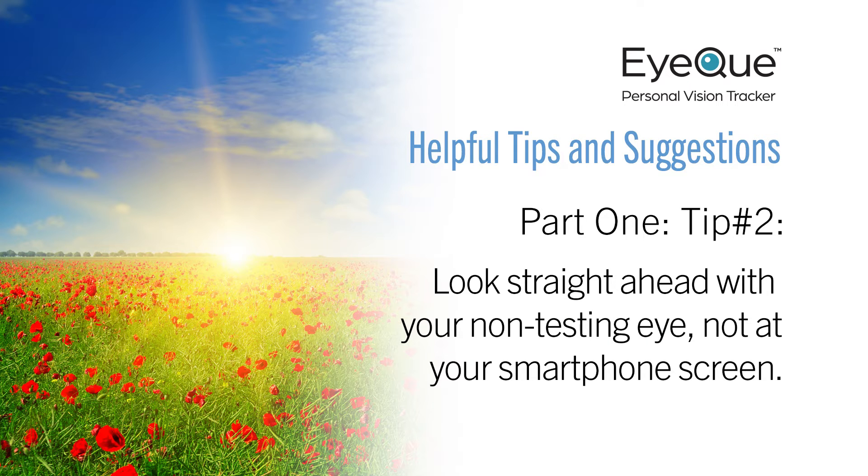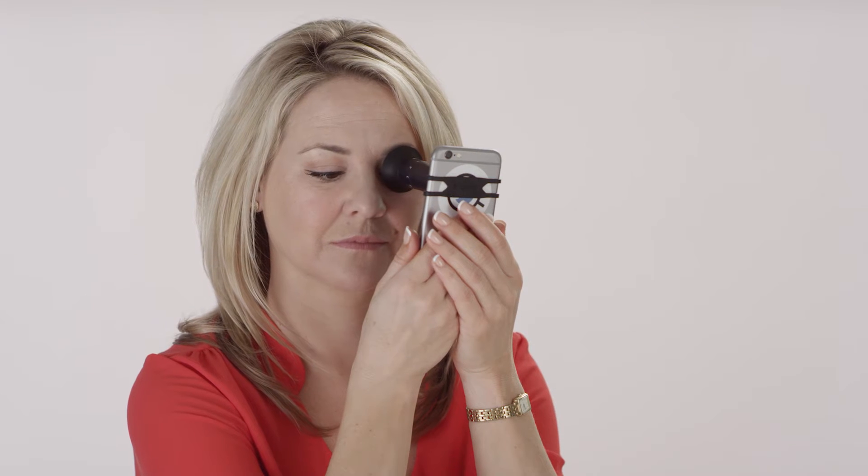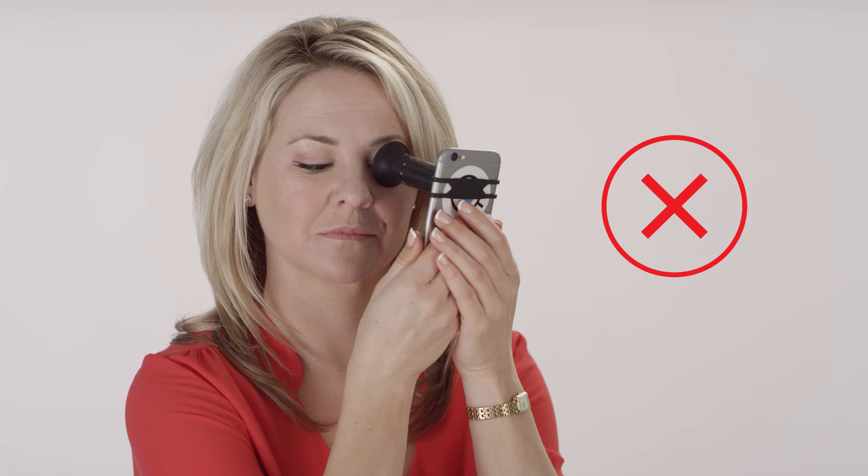During your vision test, try not to look at the Miniscope or your smartphone with your non-testing eye. If you do, your eyes will become crossed and that can be a real obstacle to getting accurate test results. We recommend that you focus your non-testing eye on an object that is six feet in front of you and continue to look at it while taking the test. If you're nearsighted, that object may be blurry, which is perfectly normal.